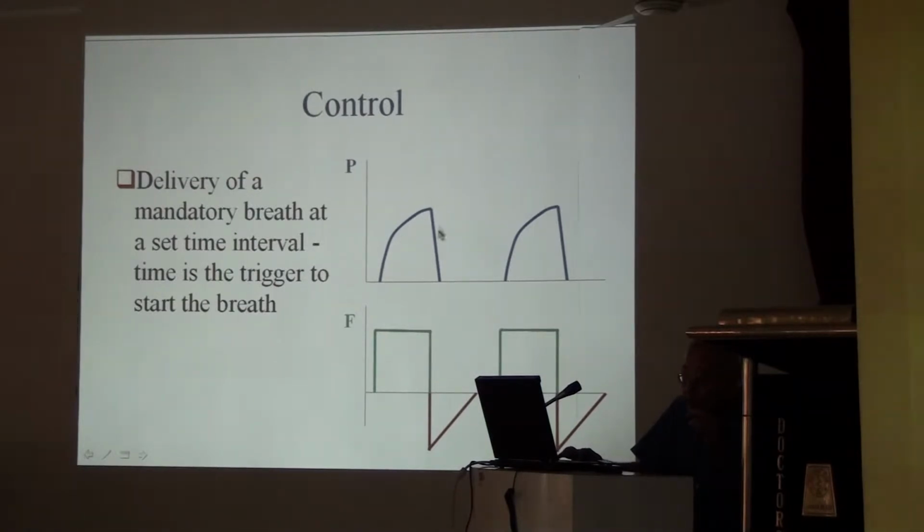So this air has gone into the patient's lung. It has to come out. How will you know? From this pressure curve, it is very difficult to understand the exhalation part. Now you need a flow sensor. This gas has gone up to this level and sustained in the lung. Now here is a blank.